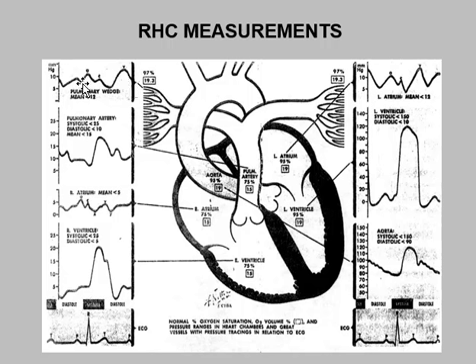Now, why is that? If you think it through with me, when you occlude that vessel, what are you recording? Remember, the vessels are flowing normally all around that occluded vessel. So pressure distal to that occlusion normalizes. And what that pressure is recording, at the end of its vascular continuity, is that the pulmonary veins drain into the left atrium.